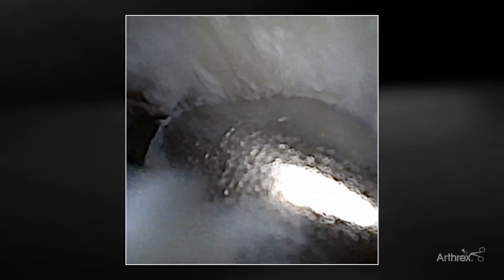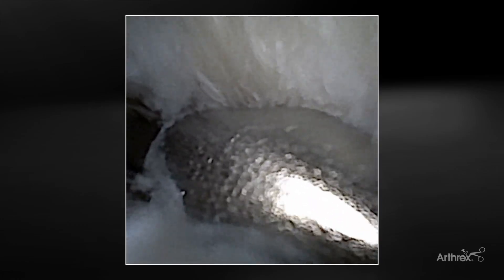There's our suction punch coming through on the radial side coming ulnarly. One of the niceties of this suction punch is that you can actually rotate it 360 degrees from the outside. If you're not comfortable with the position because of the handle, you can just rotate it and put it wherever you want to get your pathology corrected.